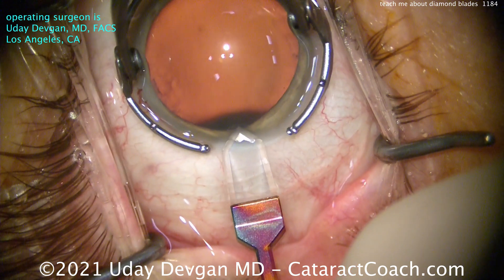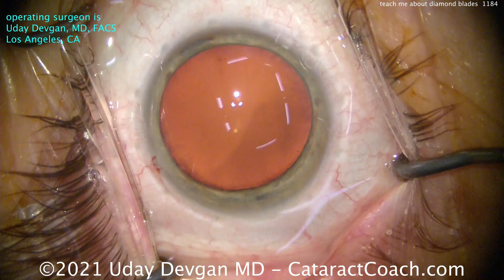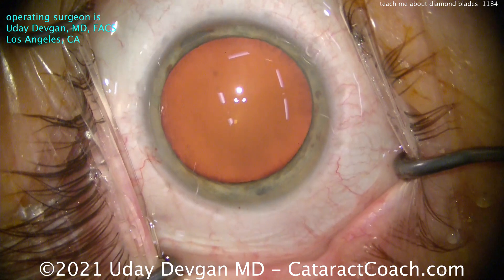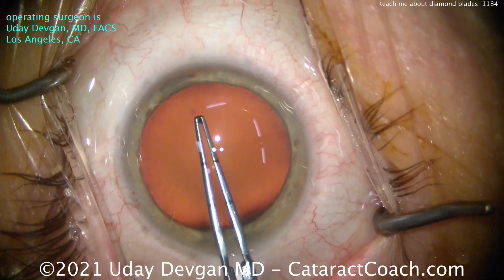Watch carefully. We'll make a nice, single, plain incision — good tunnel length. That's beautiful. Even roof compared to the floor of the incision; the architecture is great. That incision is going to seal optimally.